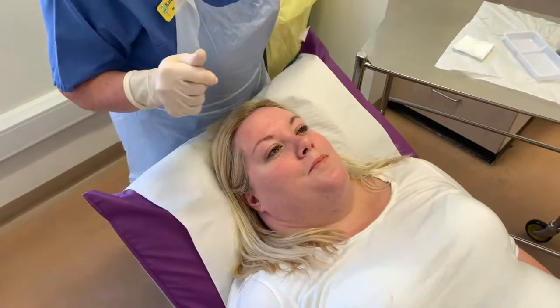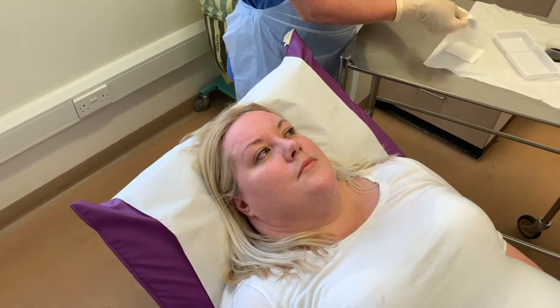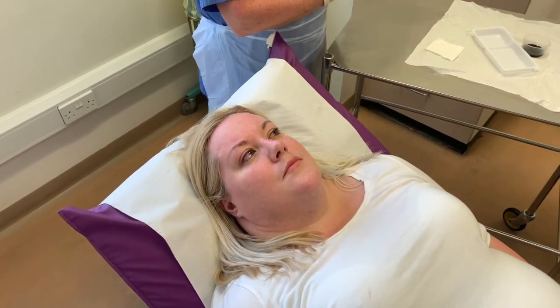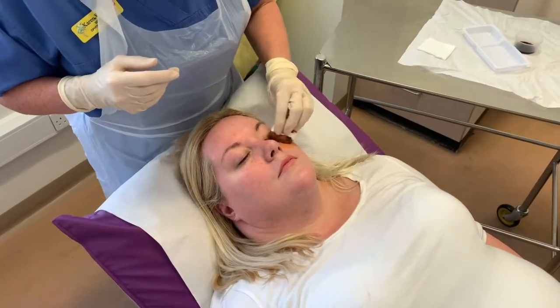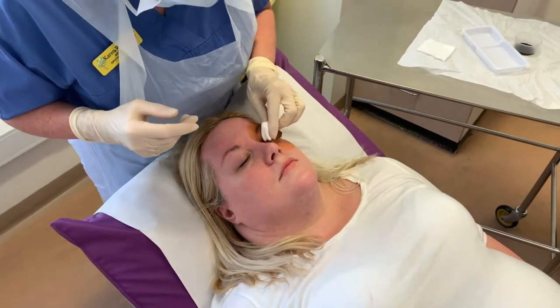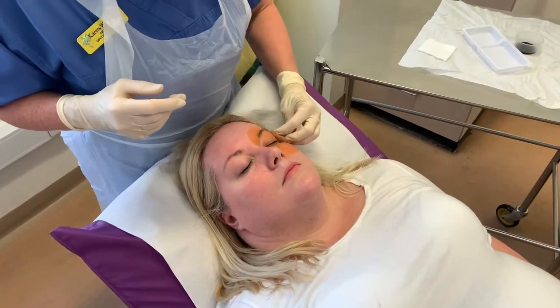Yeah, lovely. So what we're going to do again is just clean around that eye with the iodine. So shut your eye gently again for me. And just go around the eye for a bit, just into your lashes. Nice and clean.